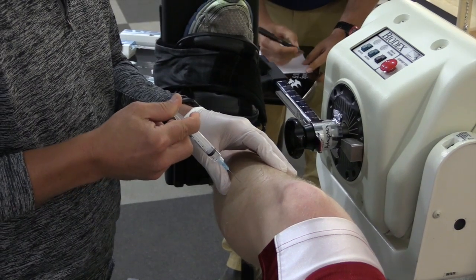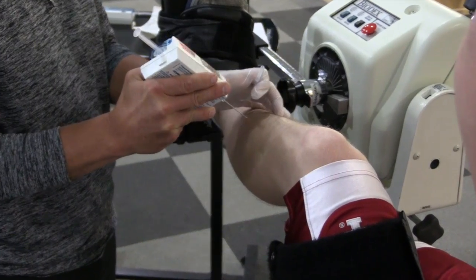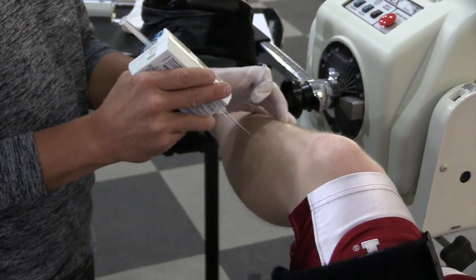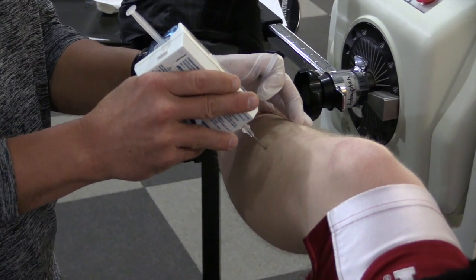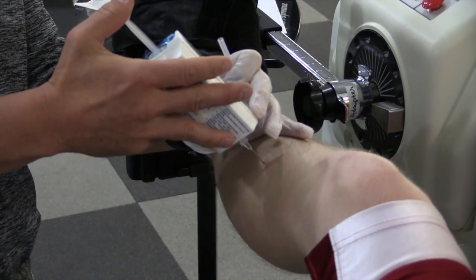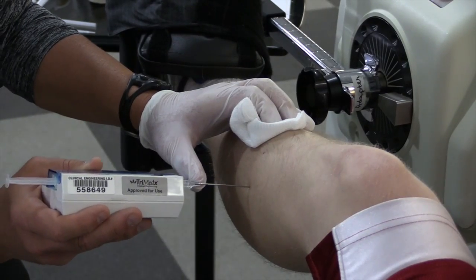After these are appropriately anesthetized, each compartment will be entered with the Striker transducer, which is the way we can obtain the pressure readings within each compartment. We are getting a resting pressure reading at this time.